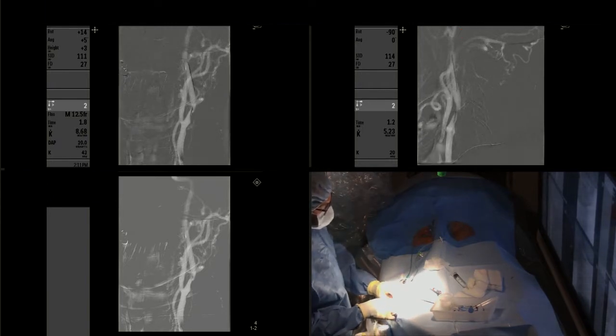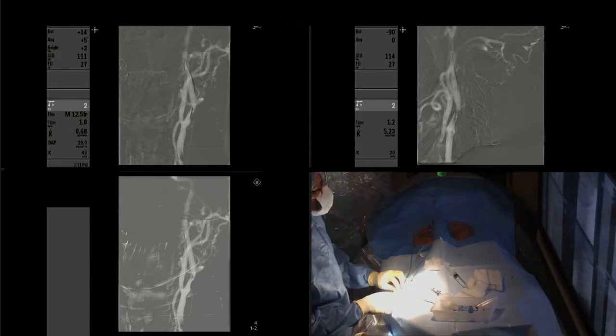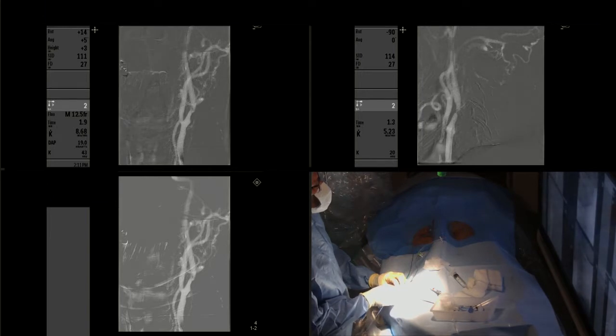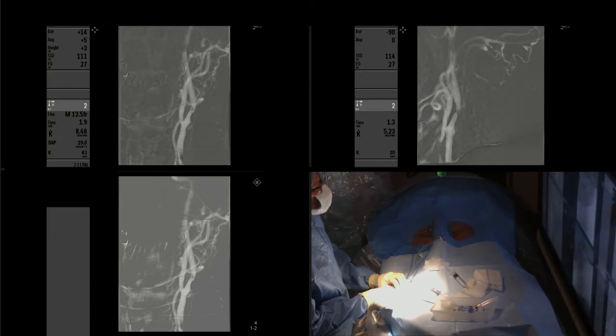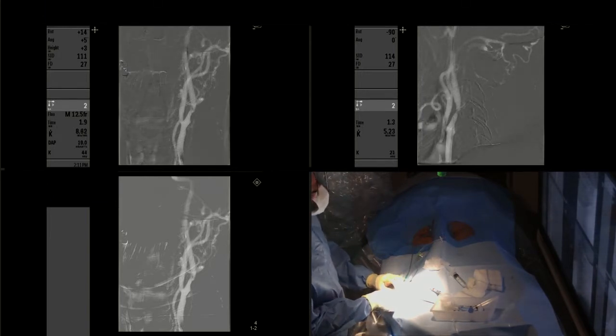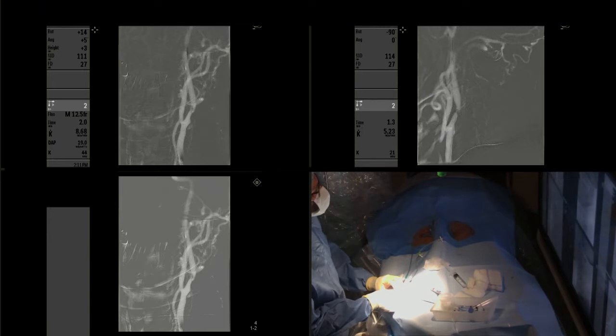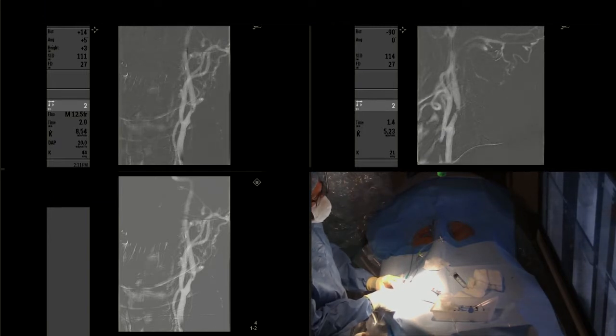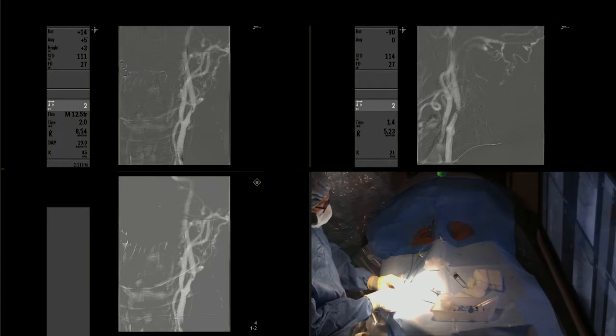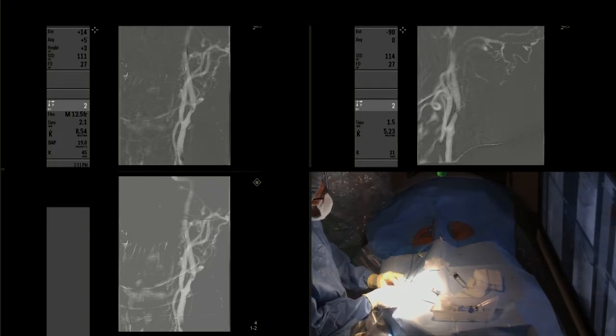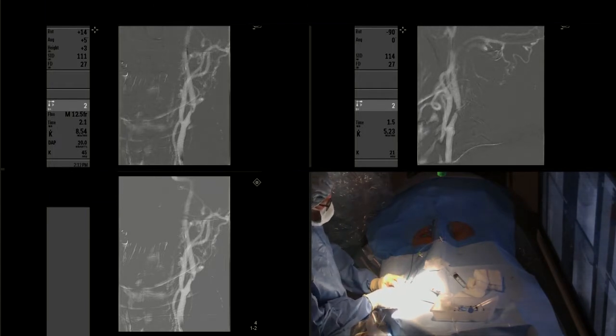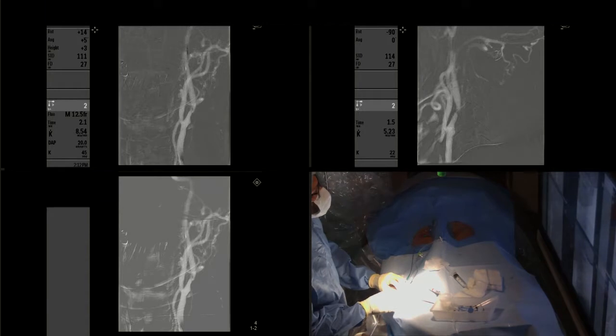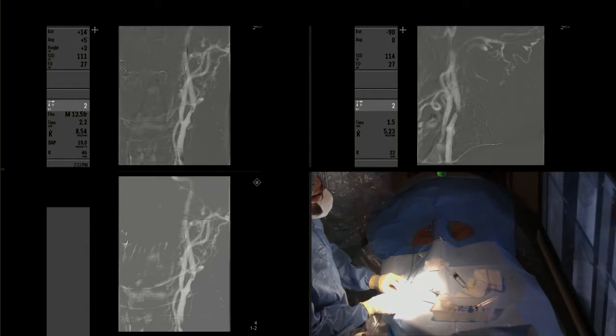You can see the arrow that points to the area in which we are advancing the micro wire. Now we will unsheathe the distal protection device that will be in place to protect from any potential risk of stroke during balloon angioplasty or stenting later on.